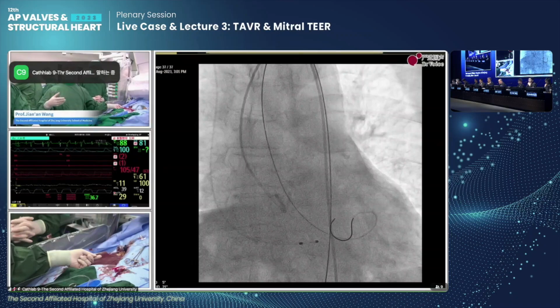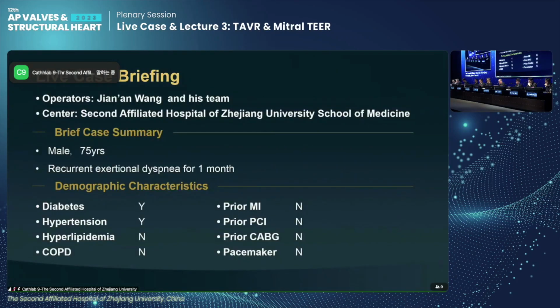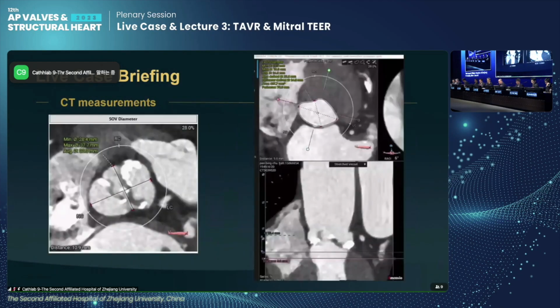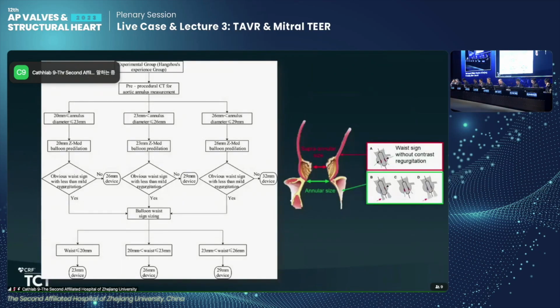你把那个幻灯片再照一下。So we can wait now for the slide. So show the slide, please. Can you see the slide? 最后那一张。We can wait here for further procedure. The patient hemodynamics is quite stable, so we can spend some time to explain the Hangzhou solution. Yeah. So would you maximize the slide?